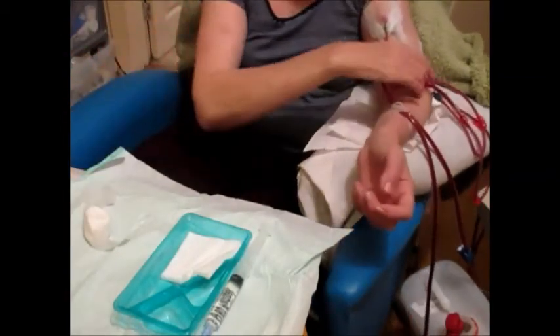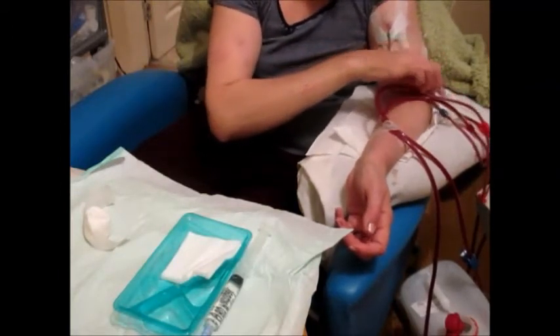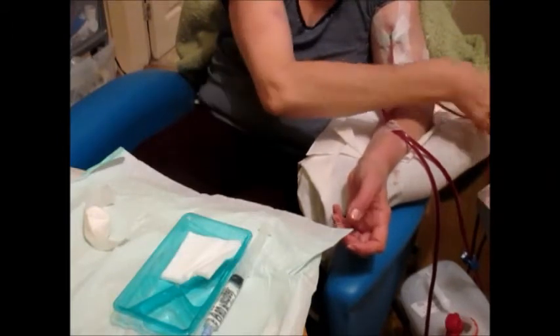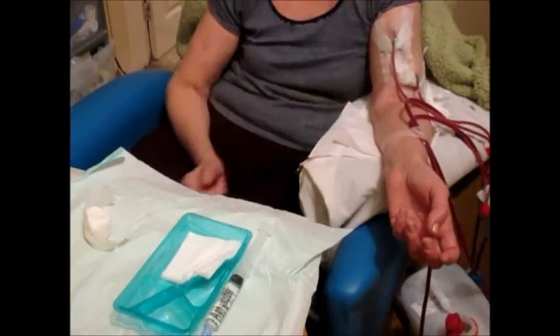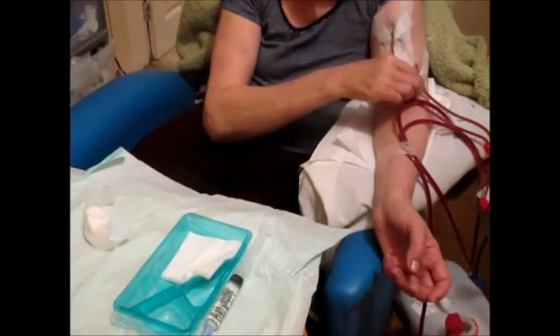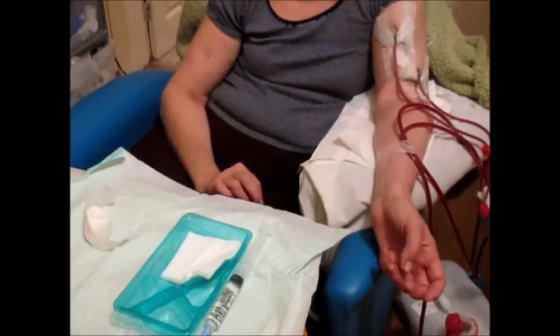I've already checked my blood pressure just before I sit up, just to make sure that I'm not going to become light-headed and feeling unwell. Just waiting for the machine to beep.